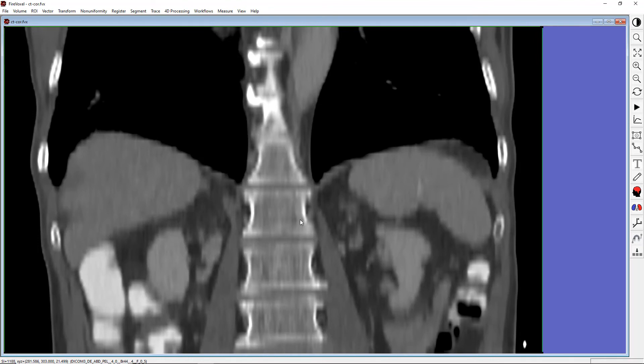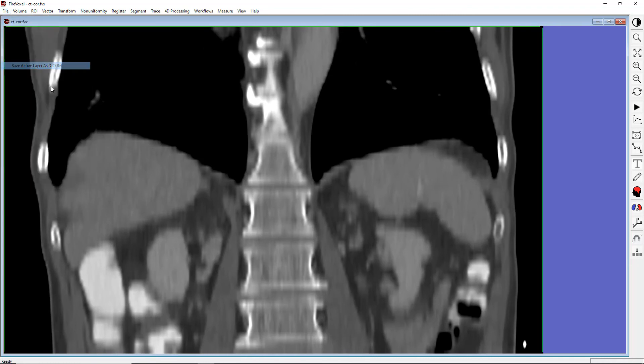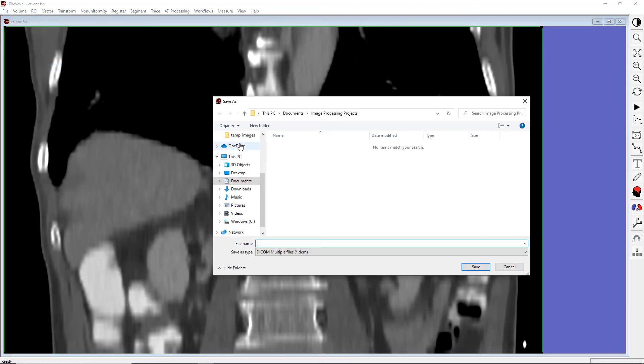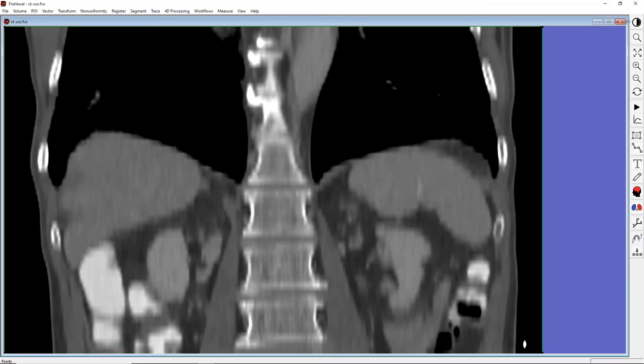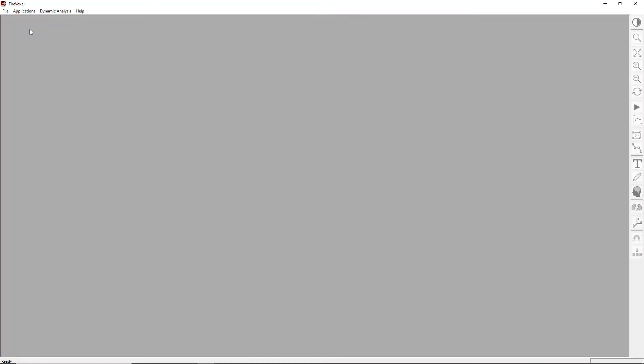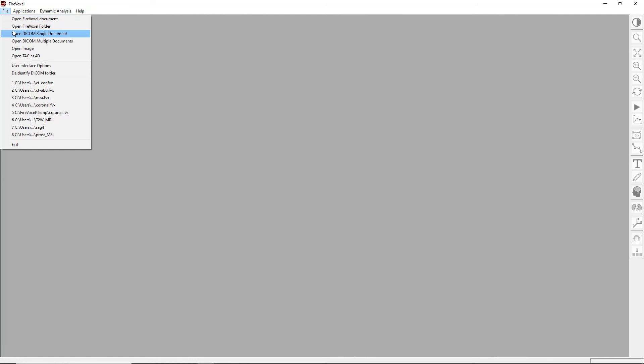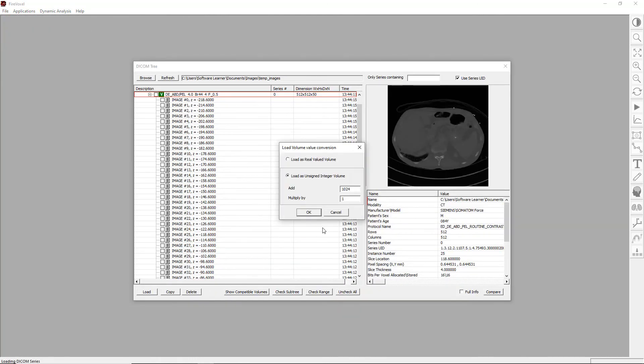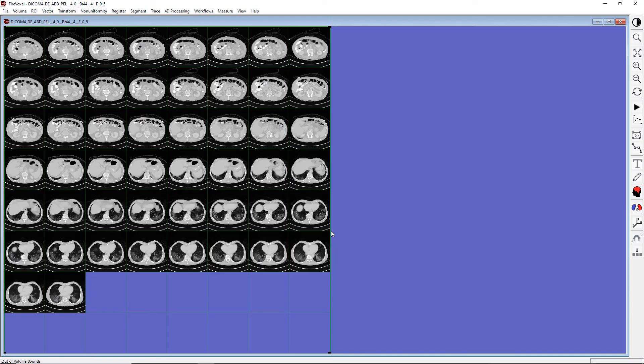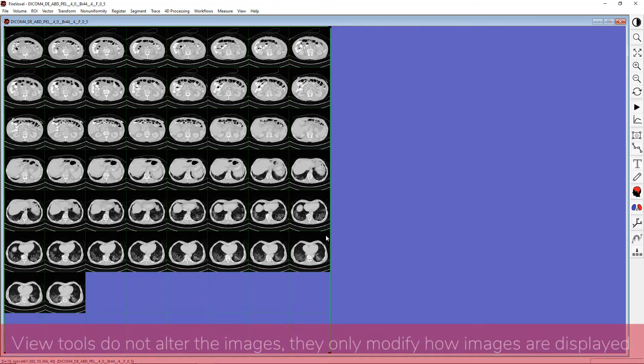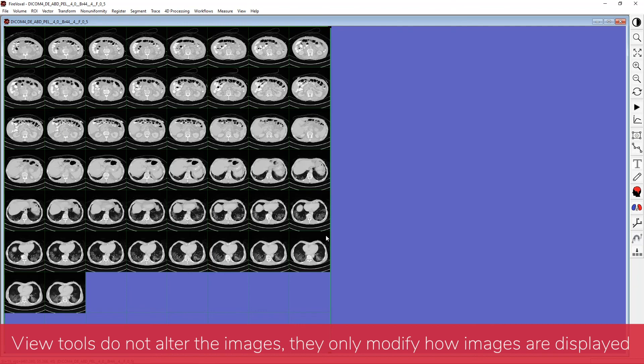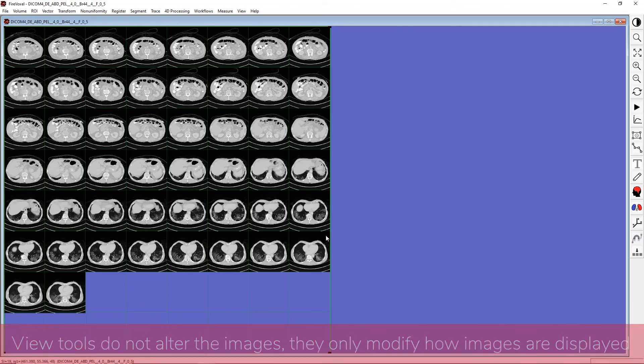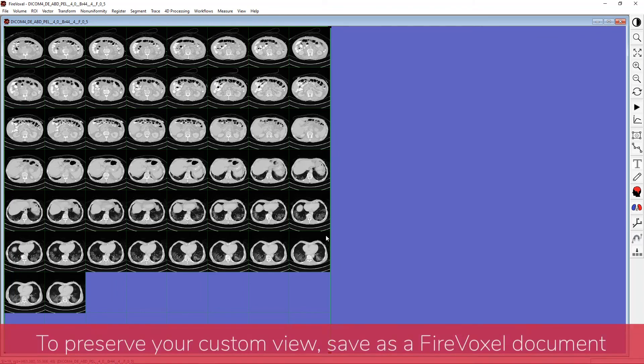Now, our original images were axial. What happened to these images when we switched to the coronal view? Let's save the images in this document using Save Active Layer as Dicom. Now, let's close this window, and now let's reload the Dicom images that we've just saved. You can see that they are axial, exactly as they were when we first loaded them. It is important to remember that all view tools, including display orthogonal projections, do not alter the images, but only modify how the images are displayed. If you want to preserve your custom view, save your work as a FireVoxel document.